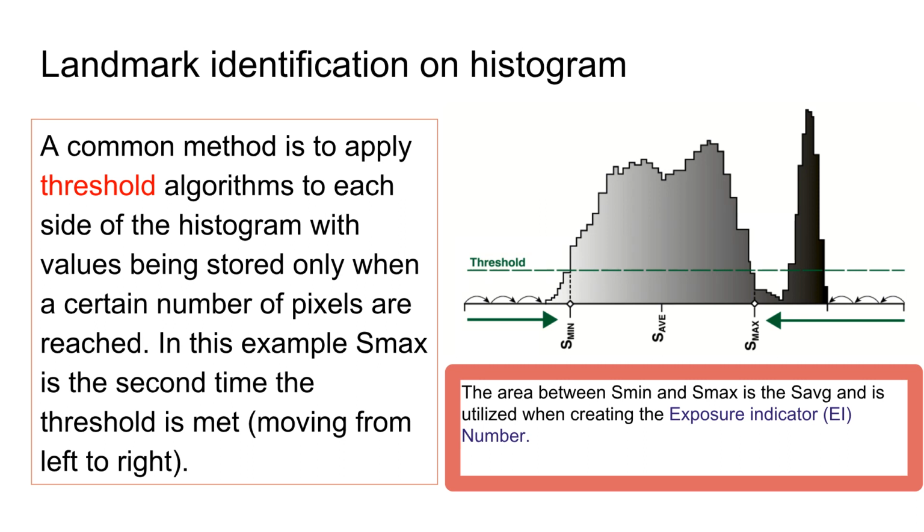And interestingly enough, the average, which would be in the middle, is known as your exposure indicator. So I suppose I could have talked about this a long time ago when we talked about exposure indicator, but I was able to hold back.